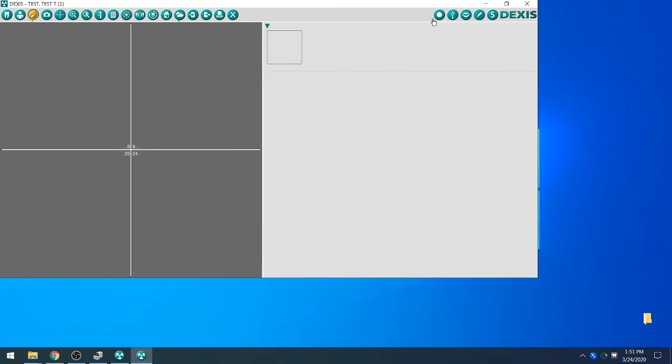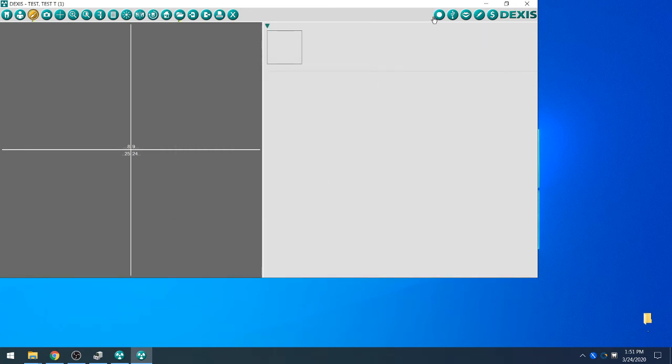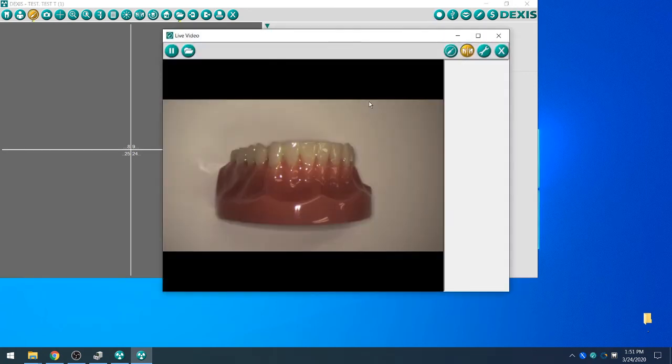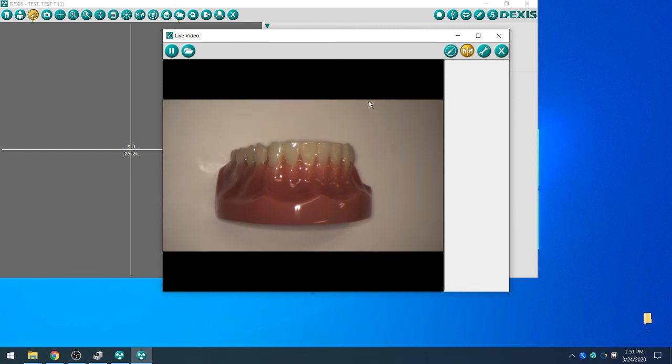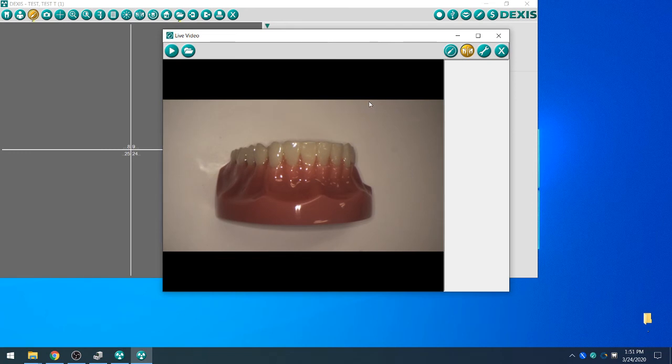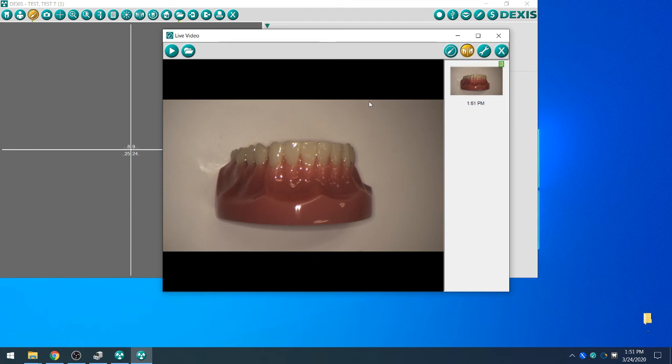We can then click on the Record icon to make sure that we're getting a live video view, and we can test our capture buttons. A quick press and release will pause the image. A press and hold will then save. Another quick press and release will go back to the live video.